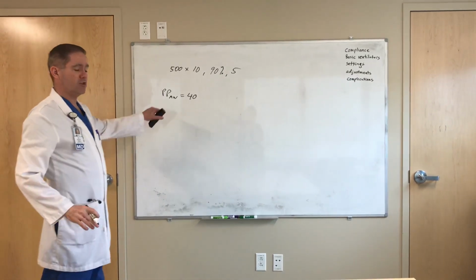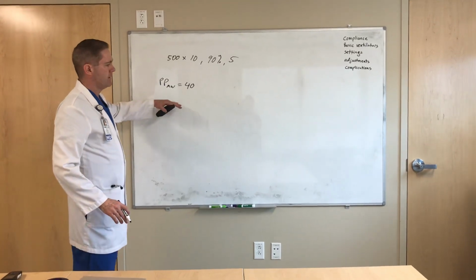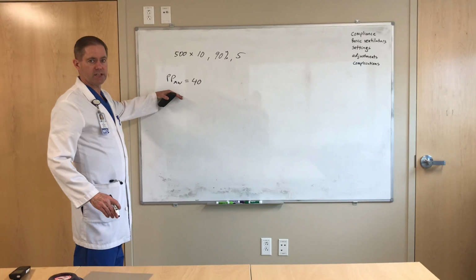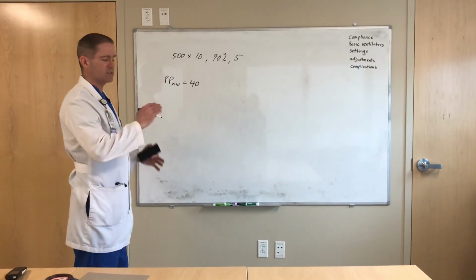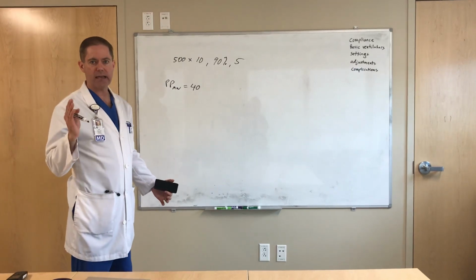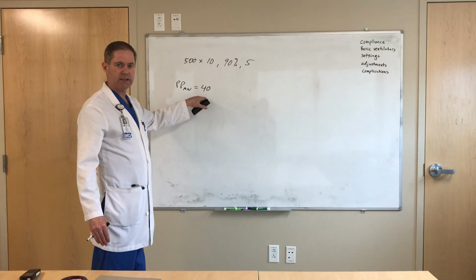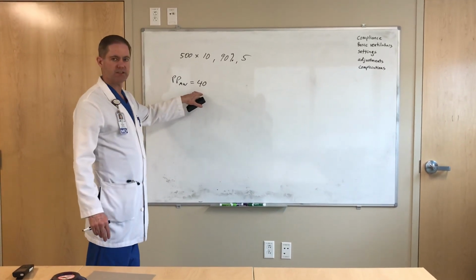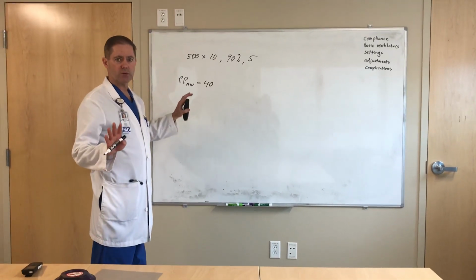Depending on the type of ventilator, you may not be able to detect what their plateau pressure is. You may have to paralyze this patient to really assess what they're doing, but you need to examine the patient. You need to look and see, is there air actually going into the patient? Sometimes when the airway pressure is real high, the machine will not deliver the breath. It'll just pop off. So you have to make sure that the patient's getting the breath. If they're getting the breath, then you have time to sort of figure it out.